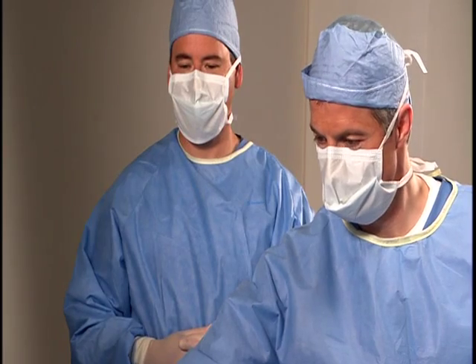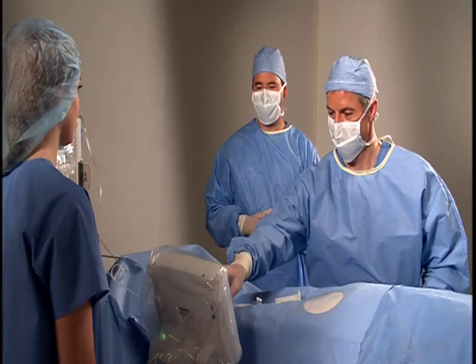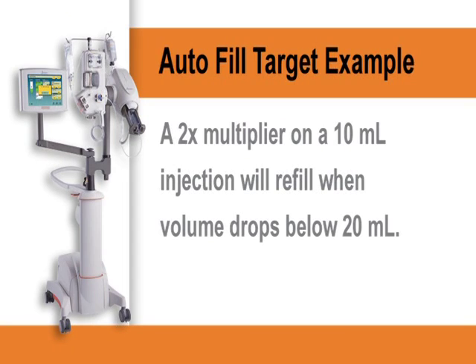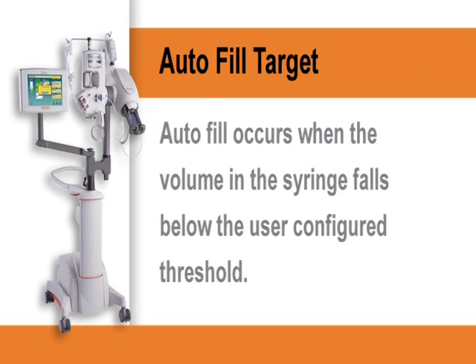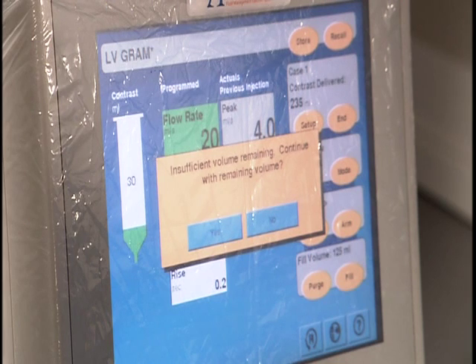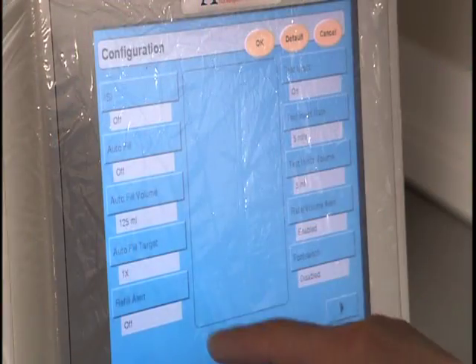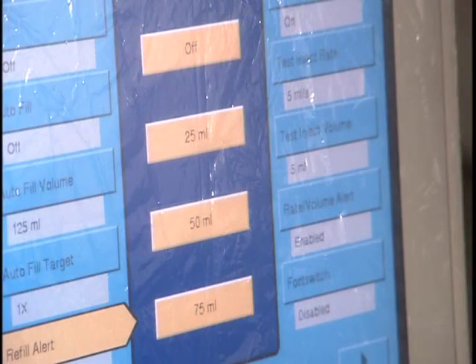You can also configure an autofill target as a multiple of programmed volume on the main protocol screen. For example, a 2 times multiplier on a 10 milliliter injection will refill when volume drops below 20 milliliters. Autofill occurs when the volume in the syringe falls below the user-configured threshold. If autofill is turned off, an insufficient volume message will appear when contrast volume in the syringe is depleted. A refill alert can be set to issue an audible indication when a preset volume of 25, 50, or 75 milliliters is remaining.